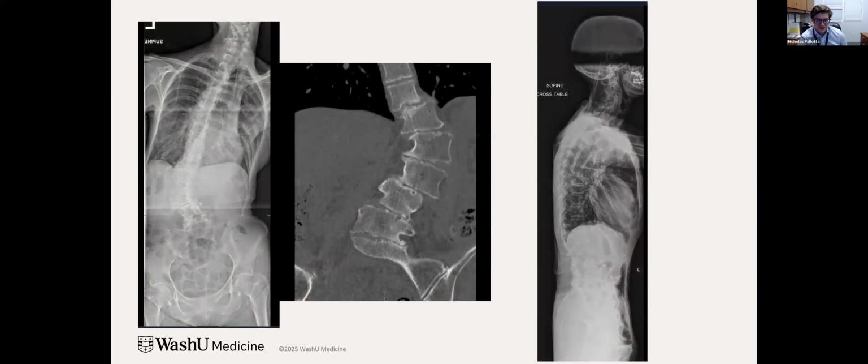And I had some hint that there was some level of sagittal flexibility because even the big skin creases that you can see on the x-ray really relaxed when I had her lay down in the office. And you can actually see that starting on the far right, the sagittal plane did correct quite well. But despite that, the coronal plane is very stiff. Though if you look on the CT scan, you don't see much bridging bone and even maybe a hint of vacuum phenomenon.